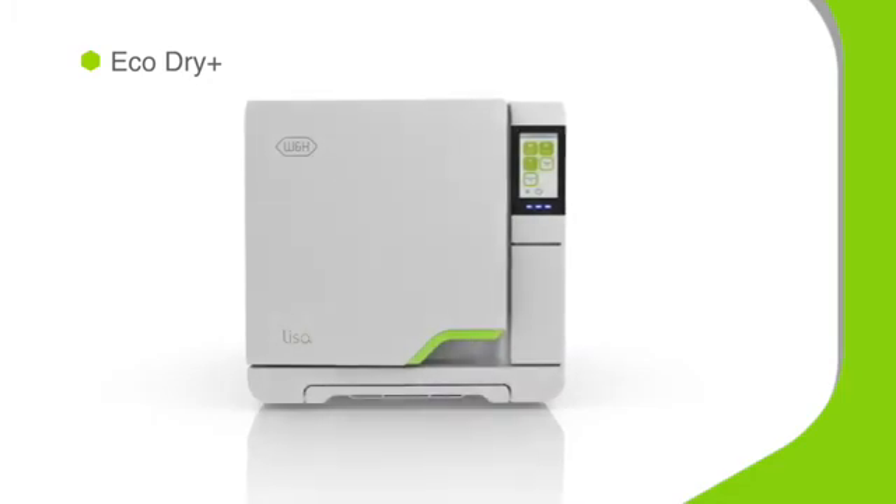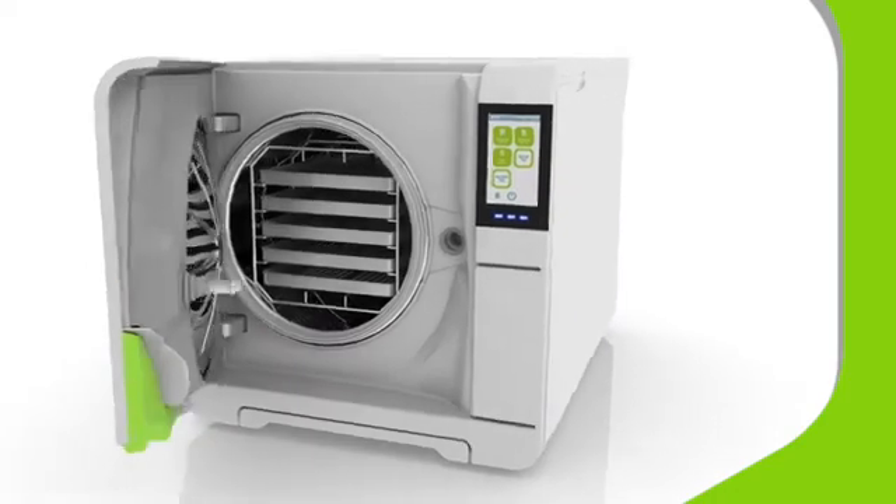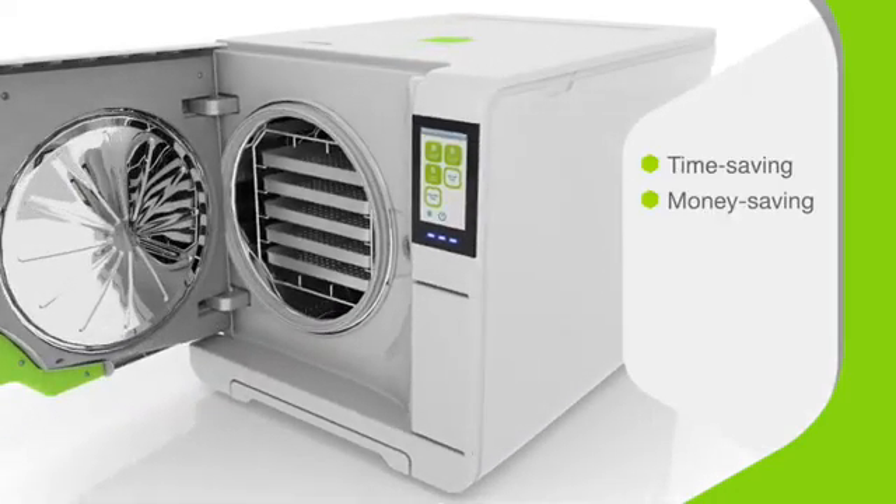By intelligently adapting the drying time to the mass of the load, Lisa's patented EcoDry Plus technology drives incredible performance. It's time-saving, money-saving, and carbon-saving — a true green solution.